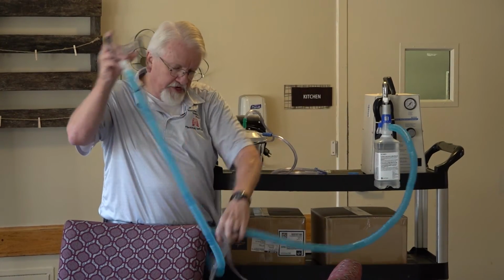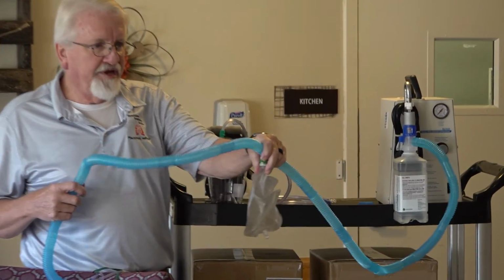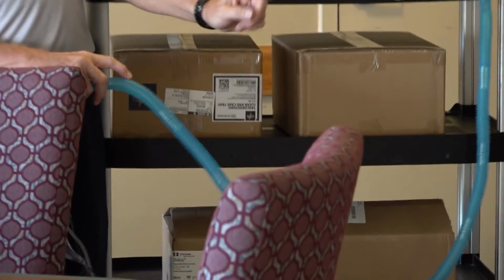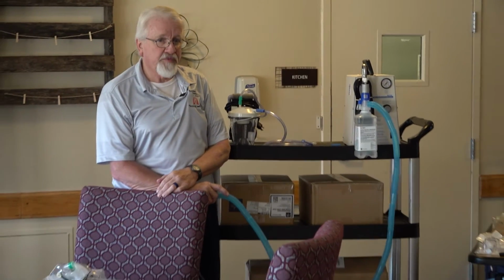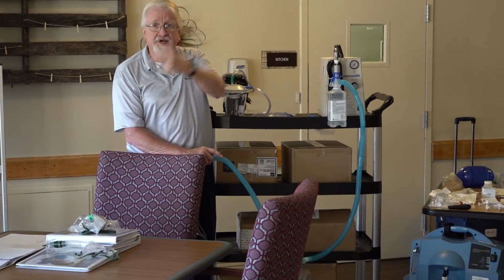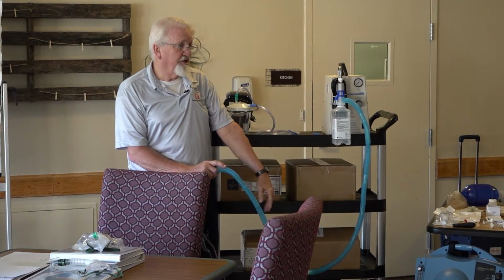Okay. The next thing in the circuit is going to be our drain bag. The idea is to have the drain bag at the lowest point between the device and the patient so that any rain out is going to end up in the bag.